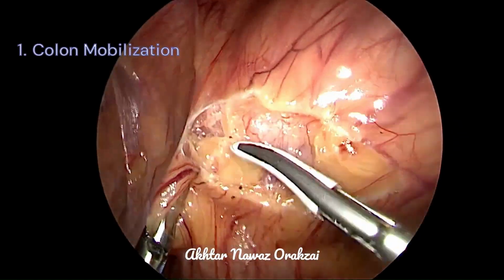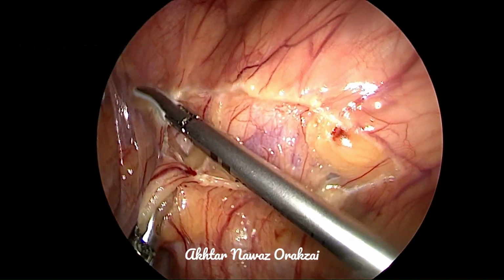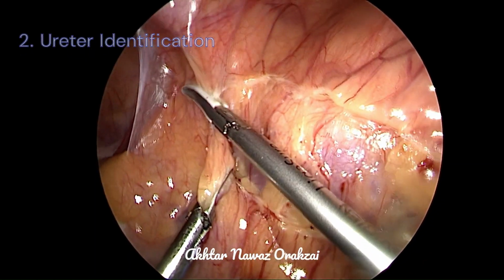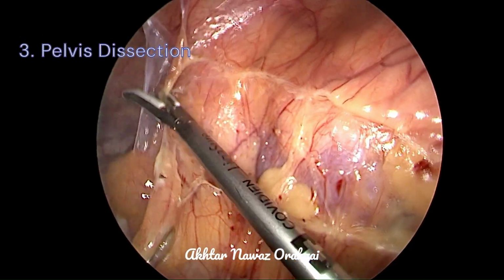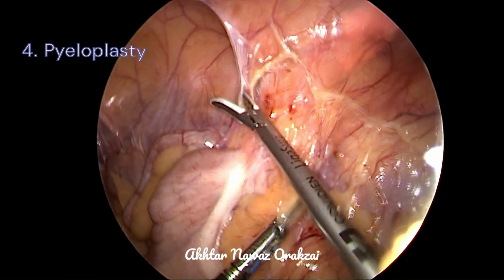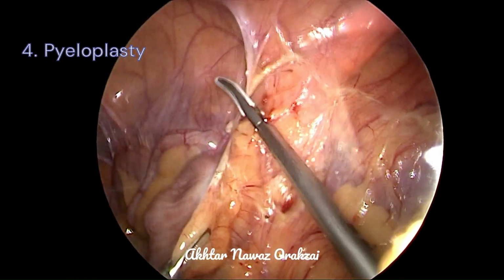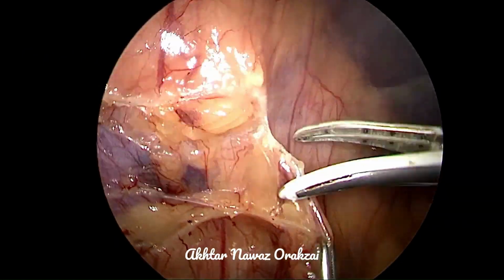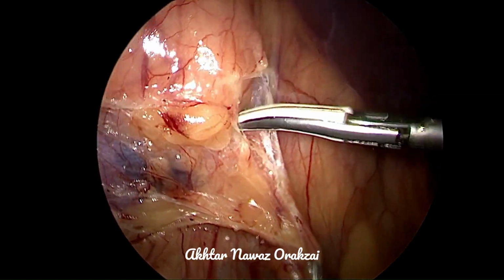Today we are discussing a case of laparoscopic pyeloplasty. The steps are the same: mobilization of the colon, then identification of the ureter, then dissection of the renal pelvis, and of course then the ultimate procedure, the pyeloplasty. So we are mobilizing the colon now.